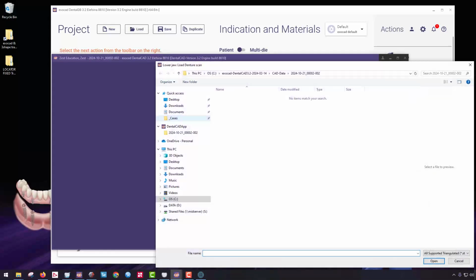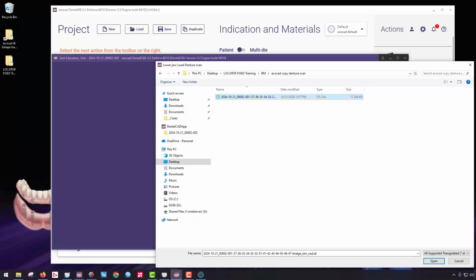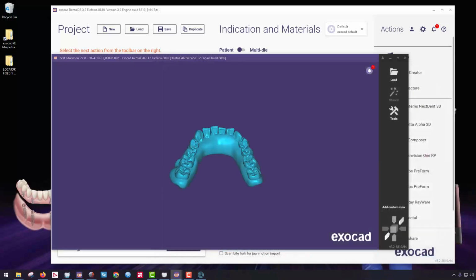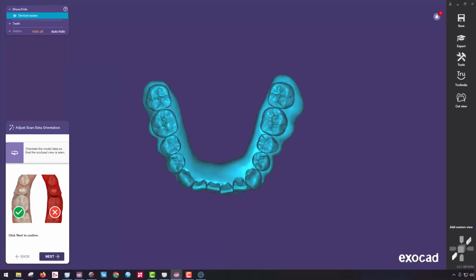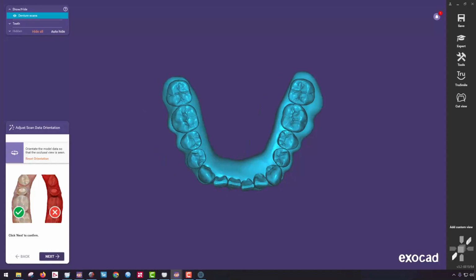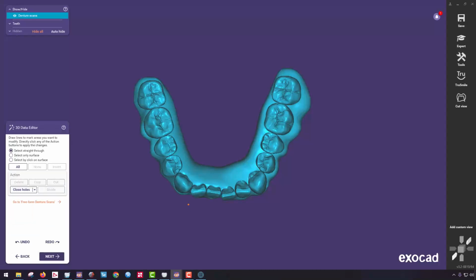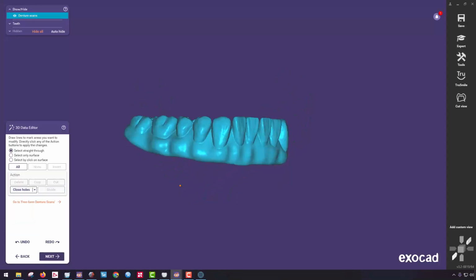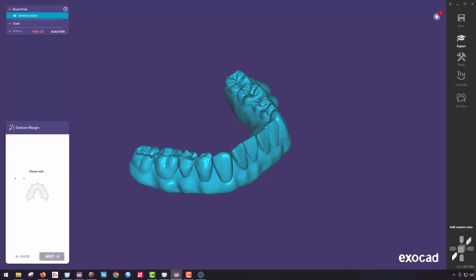Once the software opens up, I'm going to navigate to my folder on my desktop, which is my exocad copy denture scan, and pull in that file, which is the 360 scan of that monolithic design. Click the OK button, and now I'm ready to move forward. Make this big. I'm going to make sure I'm at the proper orientation, just like so. Hit the next button. I want to be right down the long axis of the occlusal. Now, do I need to adjust anything in here? Nope. Hit the next button.